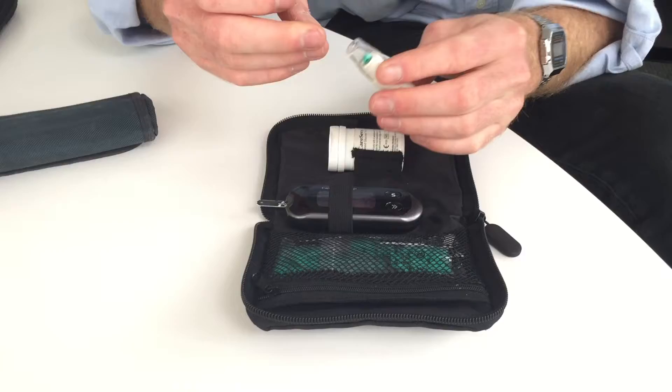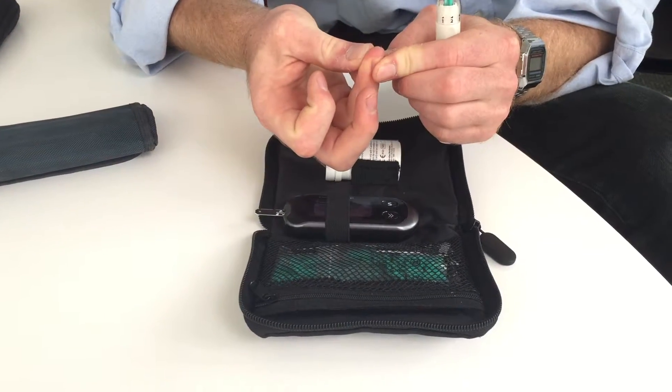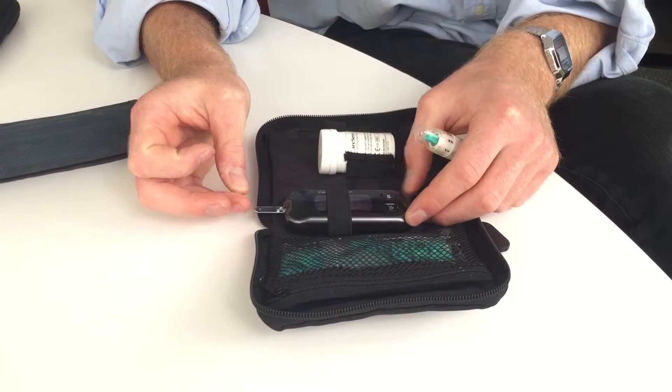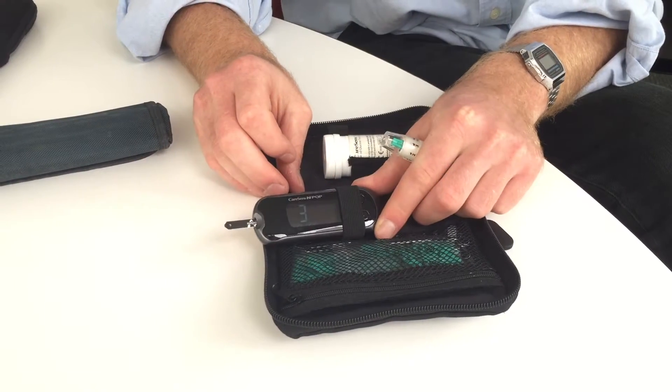Currently, when you have a blood glucose testing kit, you need to use a testing strip, and then prick your finger and allow it to read your blood glucose. That takes about 10 to 15 seconds and involves you stopping your day, bringing the testing kit out of your bag, and going through the motions.